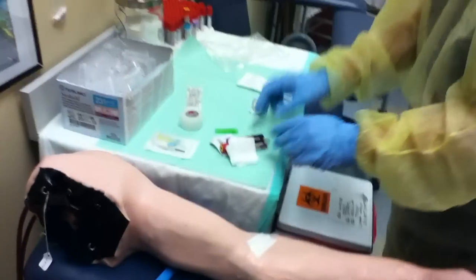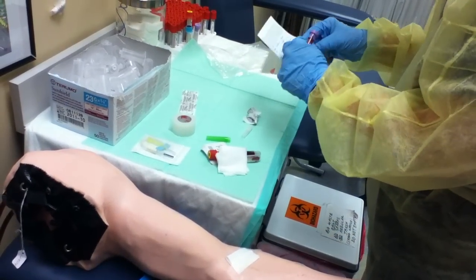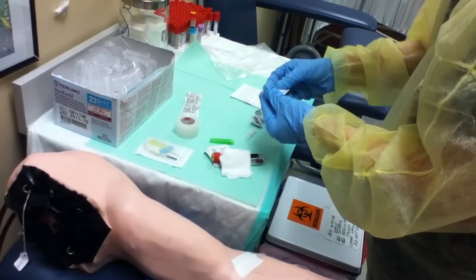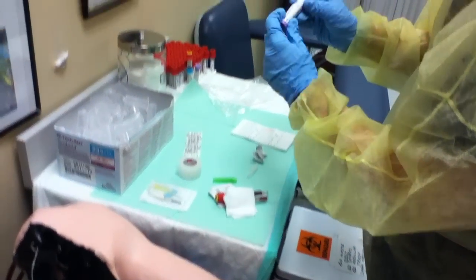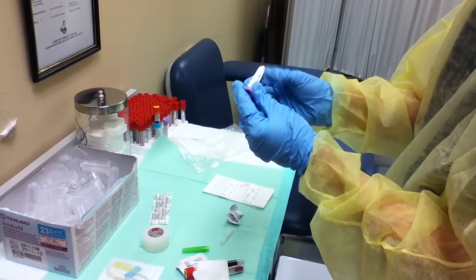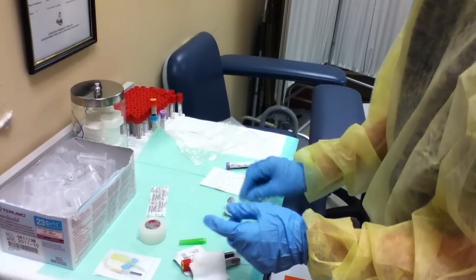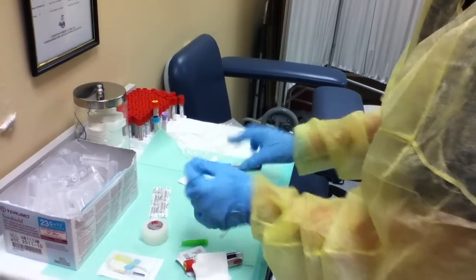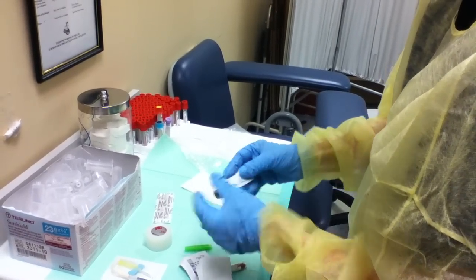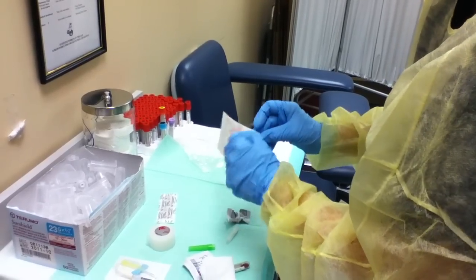You're going to come back over and label your tubes of blood. You're going to put your CBC label on. As you see, it has Joe Brown, the medical record number, the lab number, and the date of birth. You're going to have to date it, time it, and put your initials on it. You're going to do the same thing with your SST and the same thing with your PT/PTT.